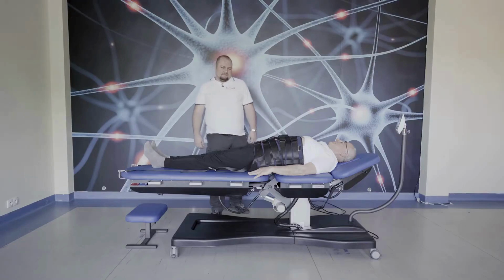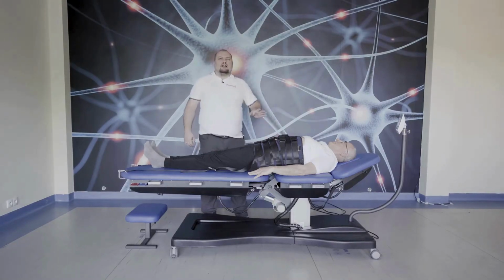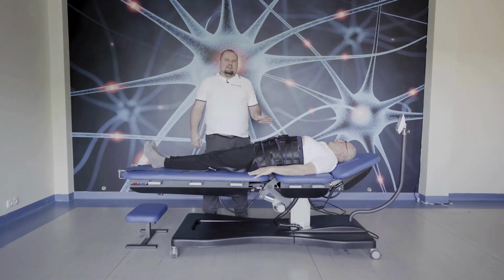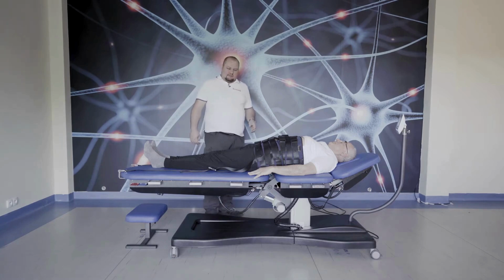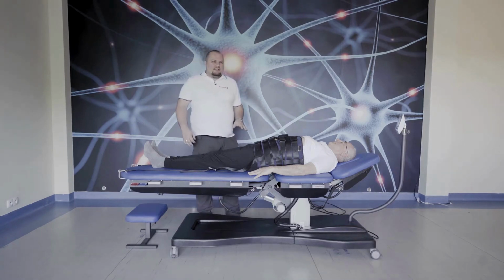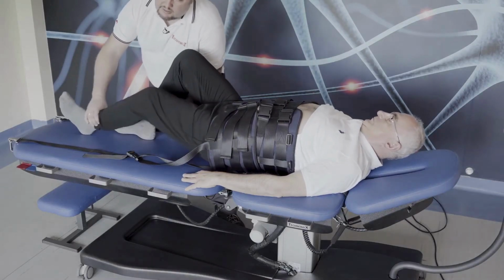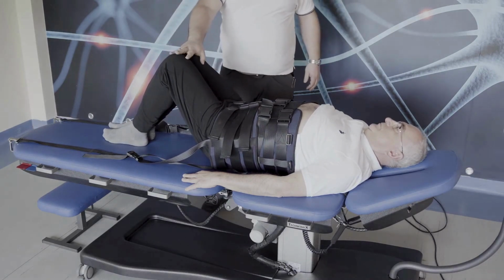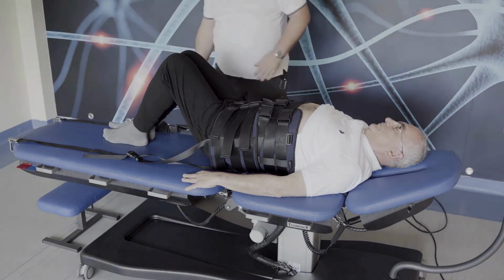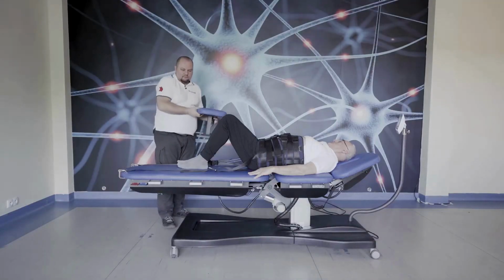Patient positioning. When you have the patient set in the belt, we should adjust the position of the patient to have the most controlled and most effective traction. We may do this using just the position of the legs, but it's sometimes hard for patients to keep this position for 15 minutes or longer. We may use a table for the patients.